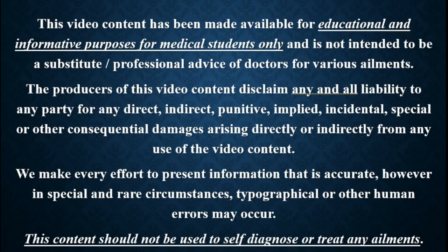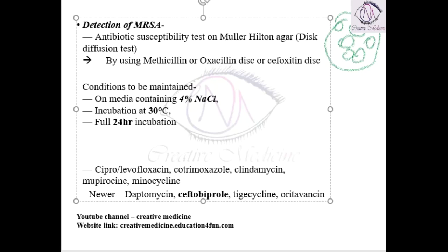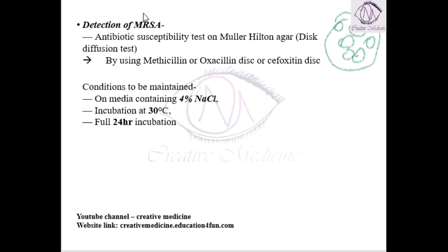In this lecture, we will learn about detection of methicillin-resistant Staphylococcus aureus. Methicillin-resistant Staphylococcus aureus is mainly detected by antibiotic susceptibility testing on Mueller-Hinton agar.